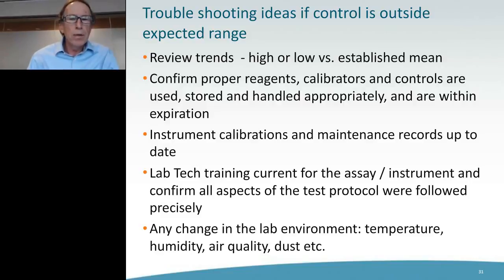You want to confirm that the proper reagents, calibrators, and controls were used, and of course, stored and handled properly. You want to make sure that your instruments are calibrated and up to date, all the preventive maintenance records are up to date, lab tech training is up to date, and everybody who uses the instrument has all the new training aspects for that particular protocol. I like to emphasize the words follow precisely. And then, of course, you can consider other variables like the lab environment to help troubleshoot if, in fact, the assay is drifting.